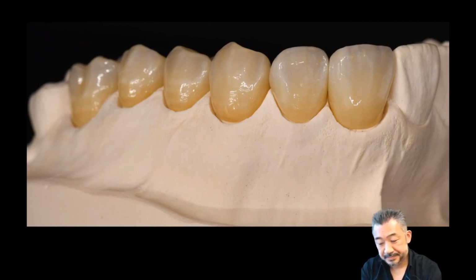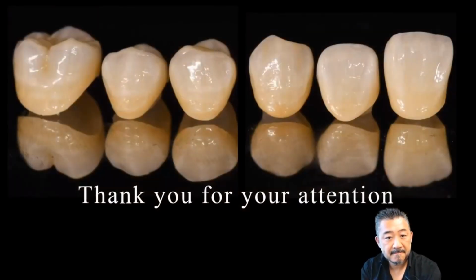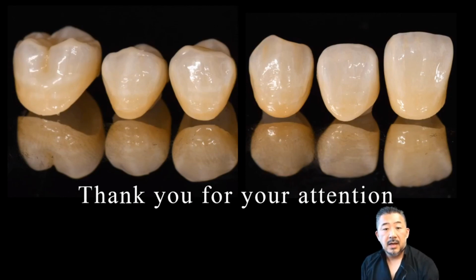See? For zirconia discs, it turned out that by using a multi-layer disc, there is almost no need to apply staining, because it is a beautiful tone, right? Okay, that's all. This is my way.